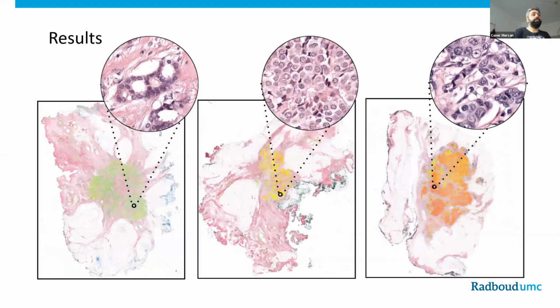Also, in the other test slides, we observe similar results, as you can see on 3 other whole slide images that further proved consistency. Here I selected 3 examples with mostly homogeneous pleomorphism across their tumor regions, increasing in grade from left to right, as evident from the colors from green to yellow to red.